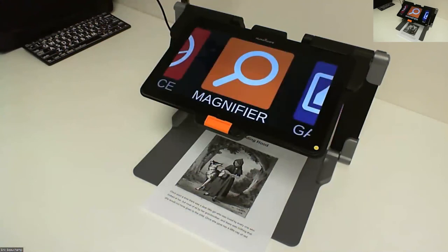I have a big question here. I'm going to answer the last part of the question here. Why should I be concerned about diamond edge being set to always versus on request? Why don't I just use the swipe on the right-hand side to change the diamond edge? You can do that, really.